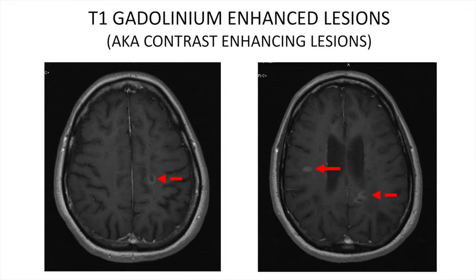Here we see examples of T1 contrast enhancing lesions, or gadolinium enhancing lesions. Gadolinium is a chelating agent injected into the vein partway through the MRI. It lights up the blood vessels so we can see them, but because of the blood-brain barrier the dye stays in the blood vessels and doesn't leave. However, with an acute new MS lesion, the blood-brain barrier becomes irritated and the dye can leak out into the brain tissue. Keep in mind that the dye only leaks out like you see in these pictures for two to maybe up to four weeks. So when you see a contrast enhancing lesion, you're looking at a new lesion right now.